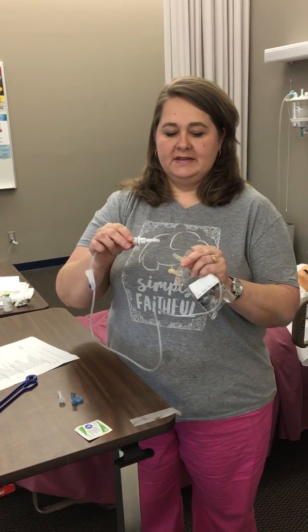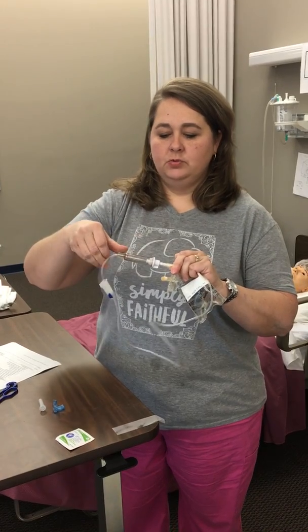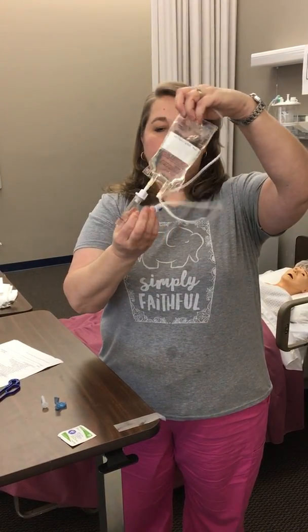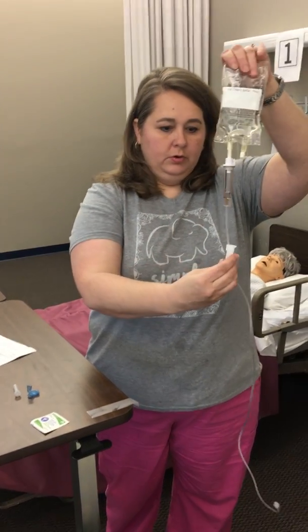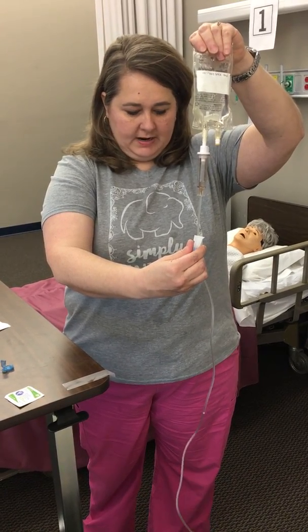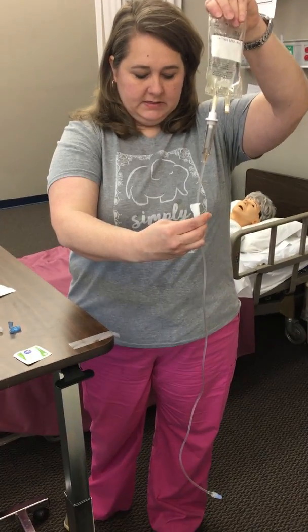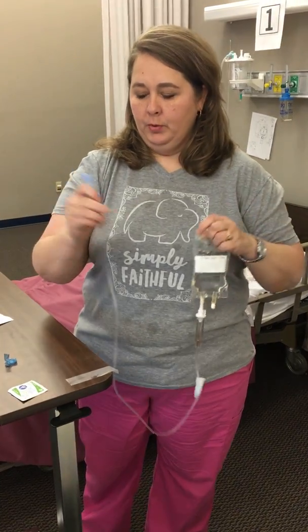Be careful that you don't touch that spike — that is considered sterile. With a little twist motion we're going to spike this bag, fill your drip chamber, and then prime your line. Open that roller clamp and carefully let that medication prime the line. All we're doing is dispersing air, because we don't want to administer air intravenously to our patient. My line is now appropriately primed.